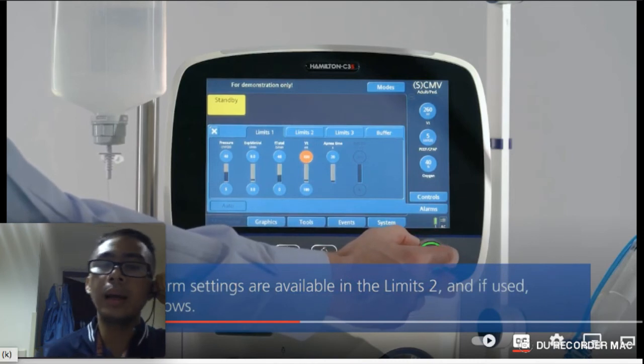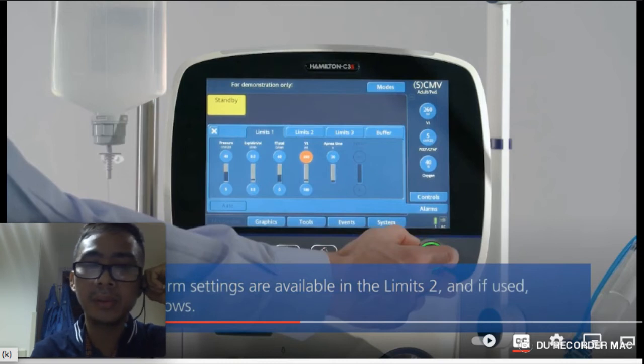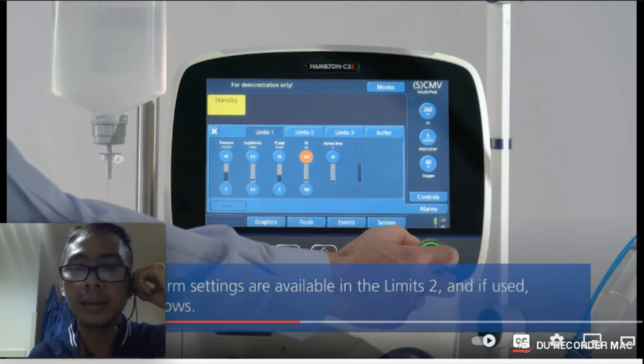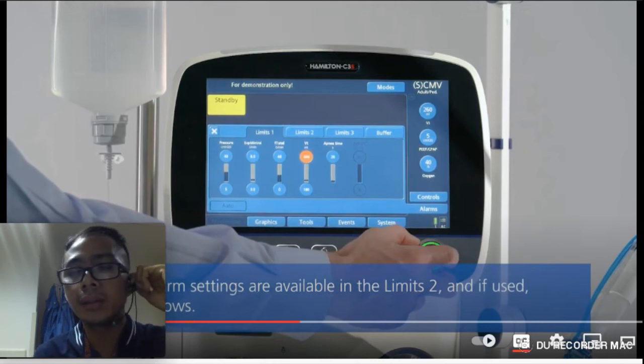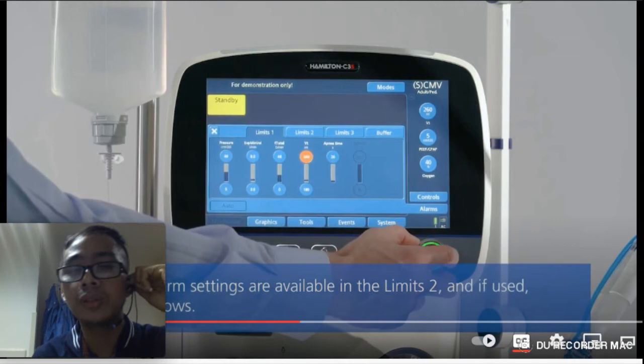So we are imposing alarms or setting the alarms in the ventilator? Is it logically necessary, or you don't need to mind setting your parameters in the alarms? What is the importance of alarm parameters to your ventilator in correlation with your ventilator management? As we discussed on the previous introduction or topic on ventilator management, di ba?